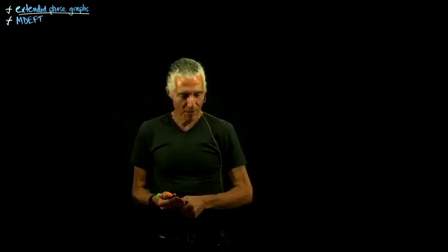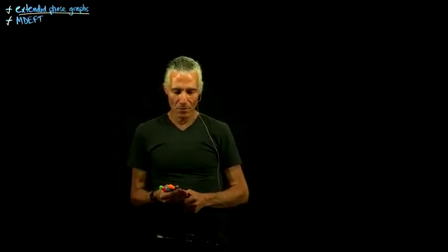Because sometimes when you talk about inversion recovery, you think of it as a preparation before you do the pulse that's going to generate the magnetization that actually generates your signal. So the inversion pulse is often called a preparation pulse.